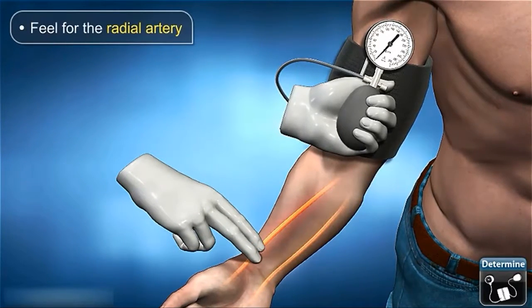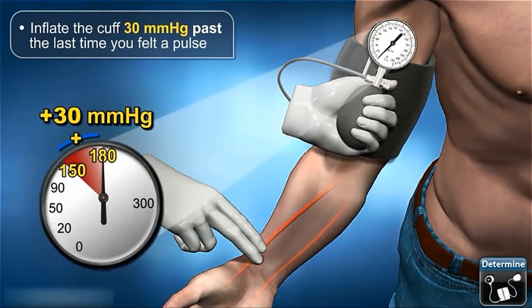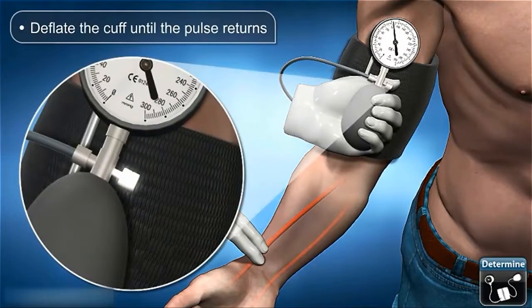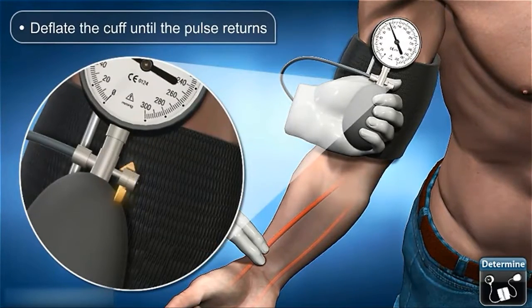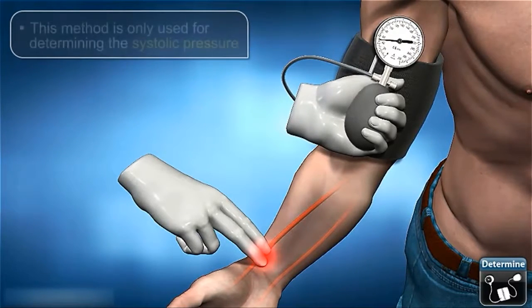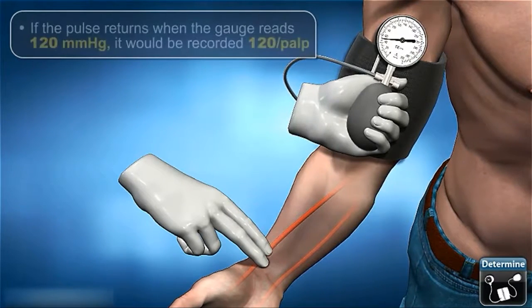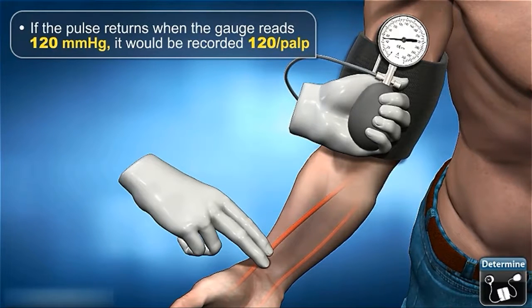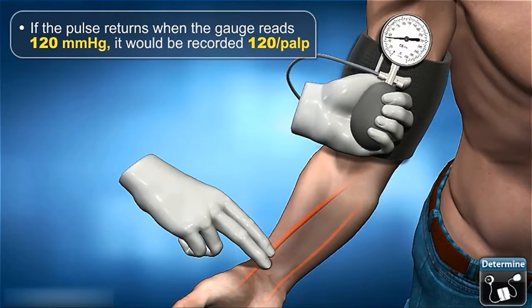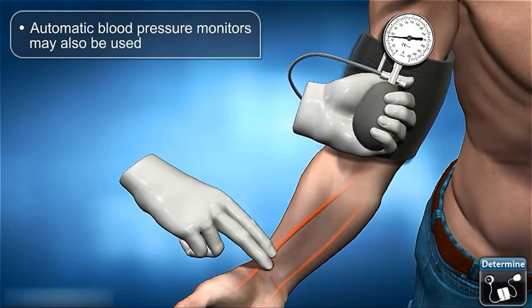Feel for the radial artery. Inflate the cuff 30 millimeters past the last time you felt a pulse. Deflate the cuff until the pulse returns. This method is only used for determining the systolic pressure. If the pulse returns when the gauge reads 120 millimeters, it would be recorded as 120 over palp. Automatic blood pressure monitors may also be used.